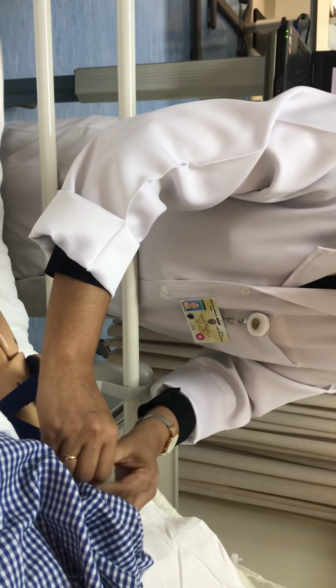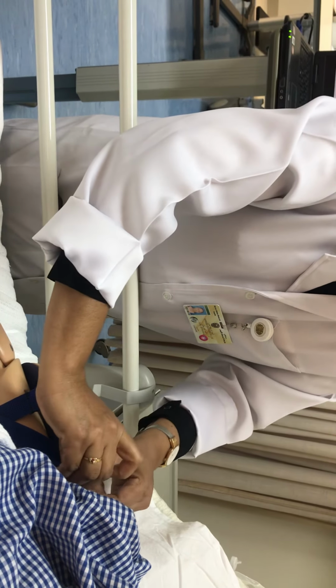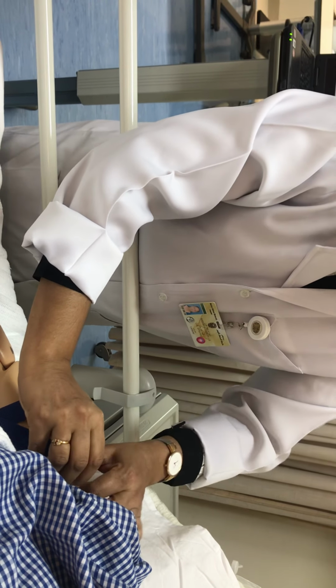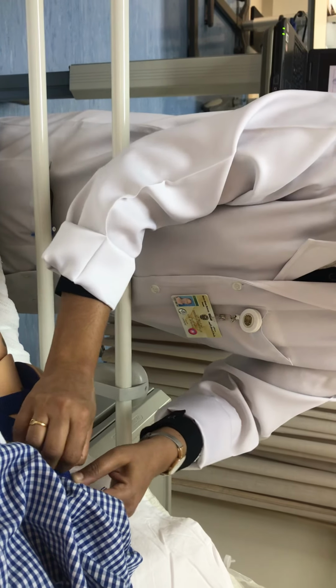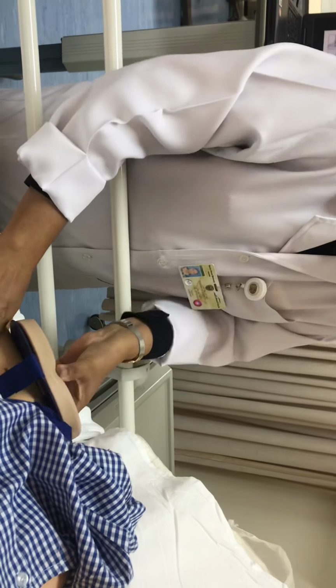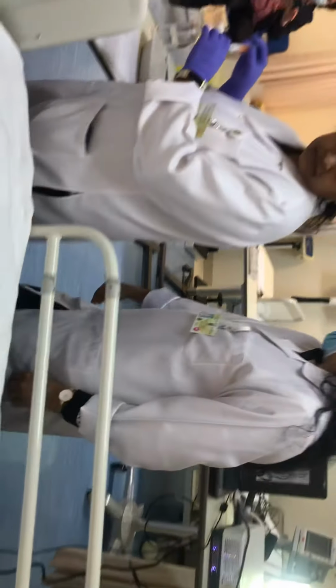All that, it is the teacher who says. They want to fix this. Yes, and some students you say I want it in the abdomen, so you see whether they are doing the position properly, supine, and whether they are able to understand. So you can change, it's according to the situation. Okay, then see if I open everything and do it.